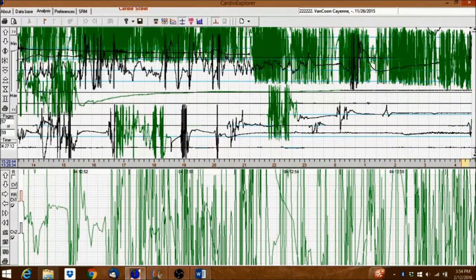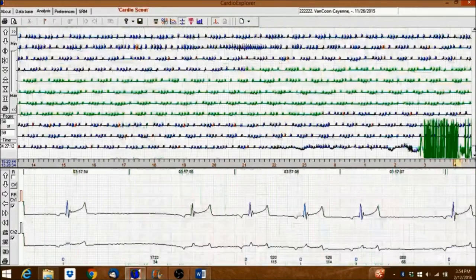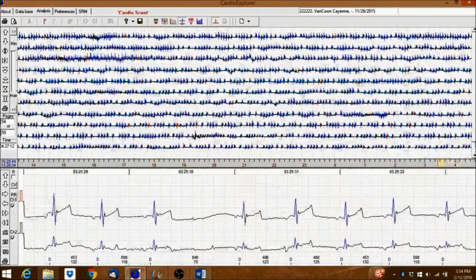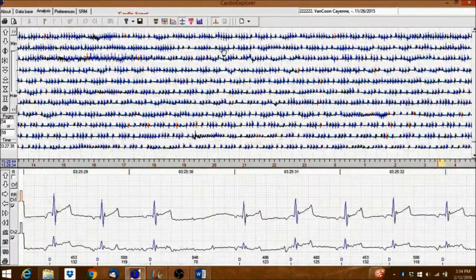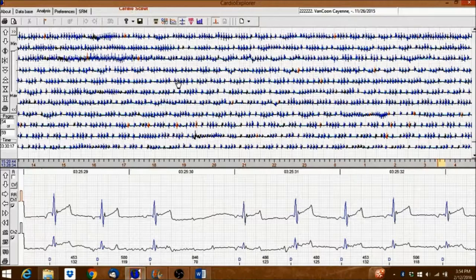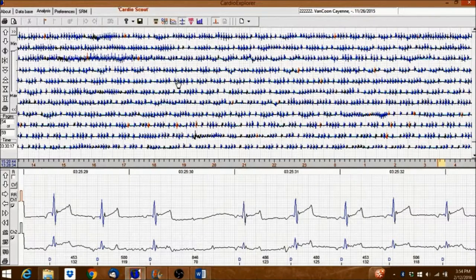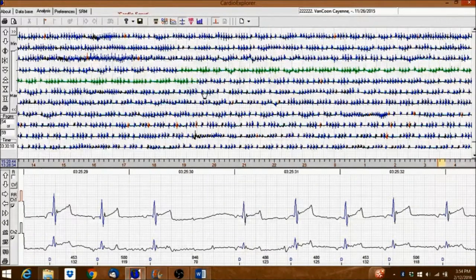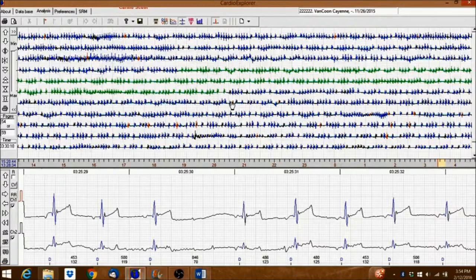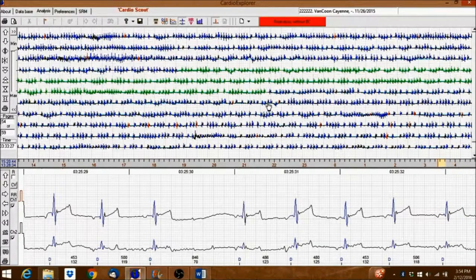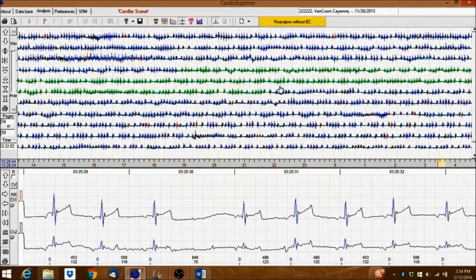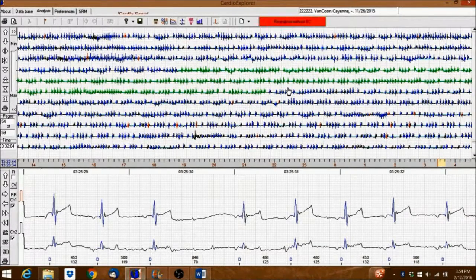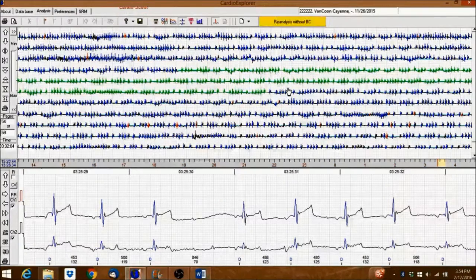You can mark additional sections green by right-clicking to begin highlighting and then right-clicking again to stop highlighting. Be careful when you highlight as this cannot be undone. Any previous work should be saved before highlighting anything green.